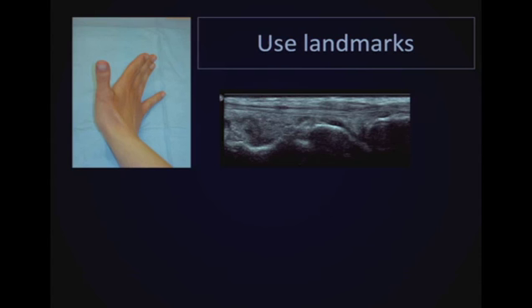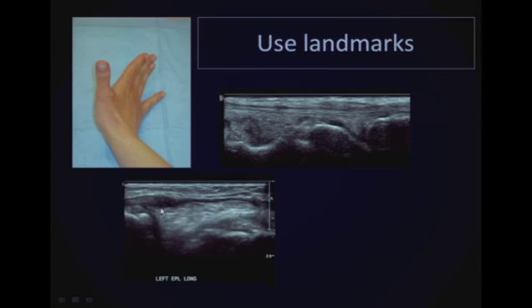But use this landmark. The EPL is actually the tendon that extends across toward the thumb and can be seen when you hyperextend or extend at the thumb. So I showed it to her on myself, and I said, look for this in this patient, and if you can't find it, compare it with the other side, which is very important. So here's an image of a normal extensor pollicis longus tendon, which was correlated with this tendon right here. You can see the fine fibrillar structure that is expected in a tendon. And here's what she found in the abnormal side.